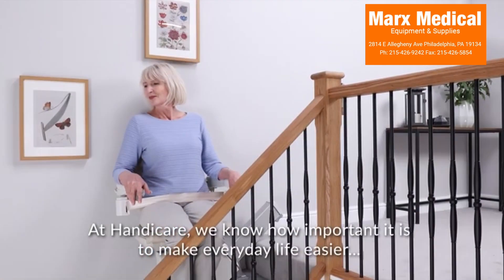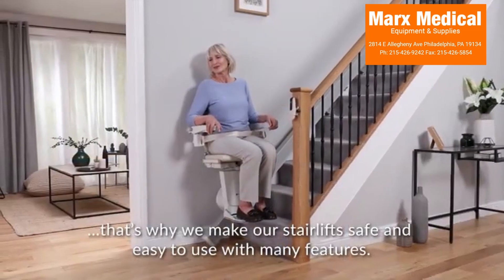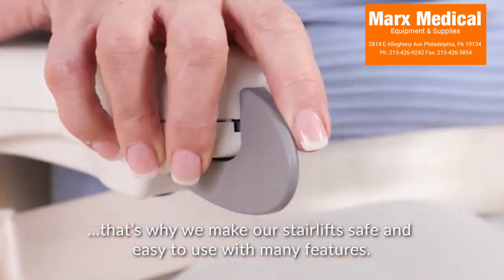We know how important it is to make everyday life easier. That's why we make our stair lift safe and easy to use with many features.